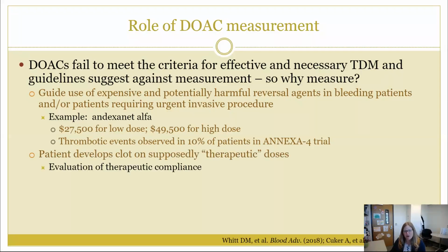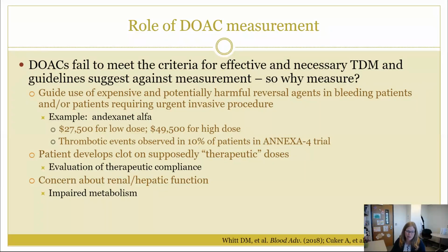And then sometimes you have patients who are on a supposedly therapeutic dose and they still develop clots. So there might be a question about therapeutic compliance. There might be a concern about impaired metabolism from renal or hepatic insufficiency. And then finally, which might sometimes be my favorite, is curiosity. Sometimes I think we all like having numbers, and we think that magically once we have a number, we will know what to do with it.